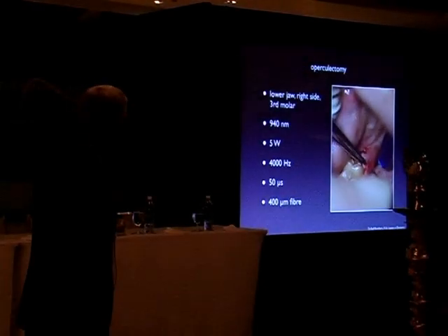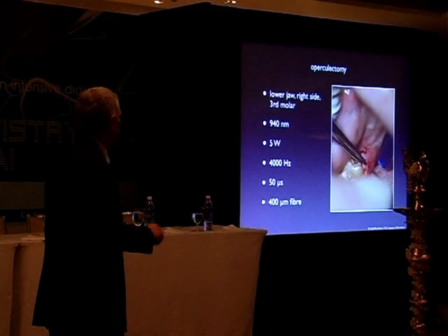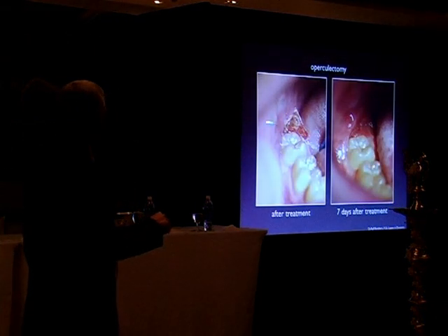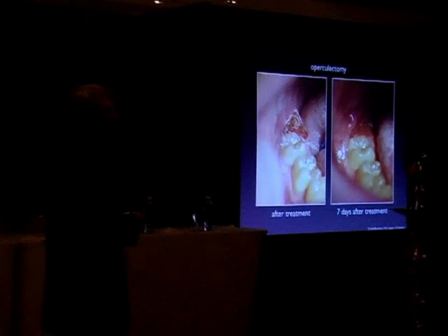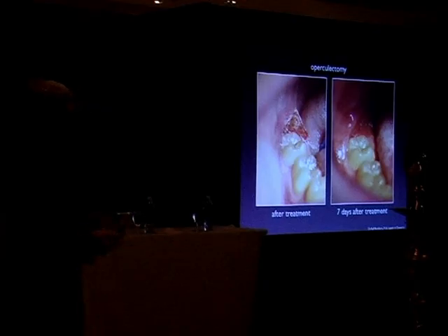If you do the same with a diode laser, this with 940 nanometers, 5 watts, you can see there's absolutely no bleeding, but after 7 days, it's not looking as good as with the erbium, because if you treat by diode lasers in surgery, it will last a little bit longer for healing than with the erbium laser, because you give more thermal energy to the tissue and it needs much longer to recreate.